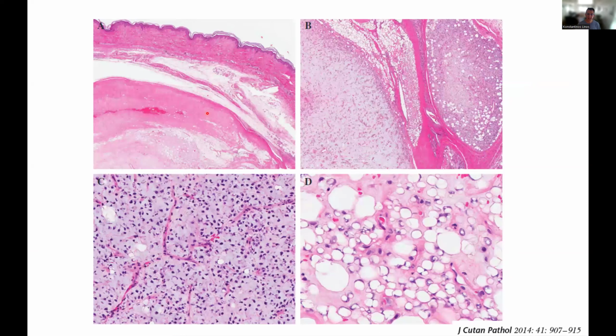It showed classic histologic features. It shows a well-circumscribed myxoid neoplasm centered in the subcutis. Well, you have the multilobulation separated by collagenous septae with hypercellularity along the periphery. The myxoid sarcoma cells are uniform.